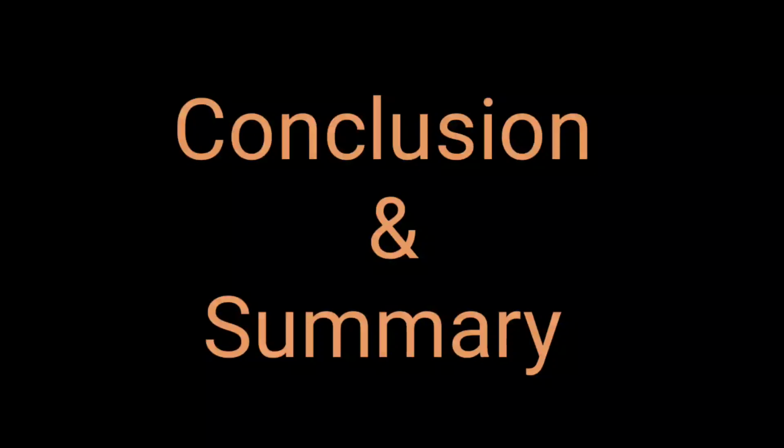Besides this, I discussed the primary carcinoma, and I've shown you the slides where you can think of primary carcinoma and metastatic deposits as well. Focal adenomyosis was also on the list. You may think of incomplete abortion in case of an available history of a previous positive pregnancy test, and also hydatidiform mole as well. So hopefully you will benefit from this video.